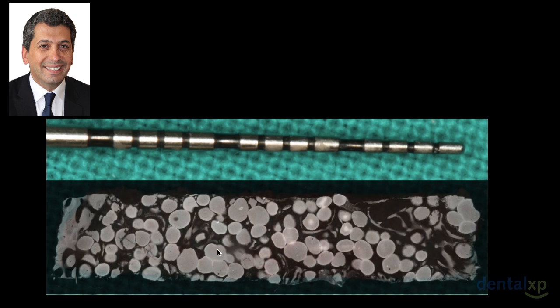You can see this is the biomaterial. It's a bioceramic in this case. And you see the newly formed bone between those bone particles or sometimes in contact with these bone particles. And the more you go apically, we can still find that we have a lot of new bone formed in this biopsy.